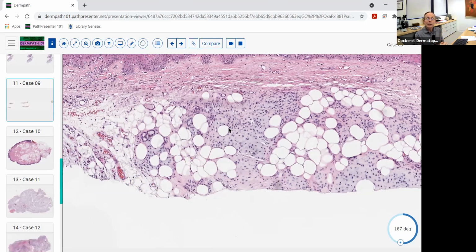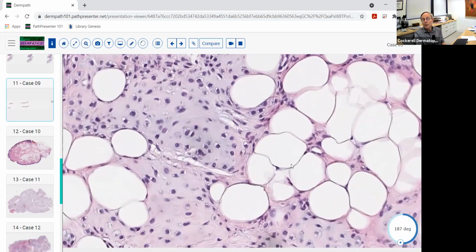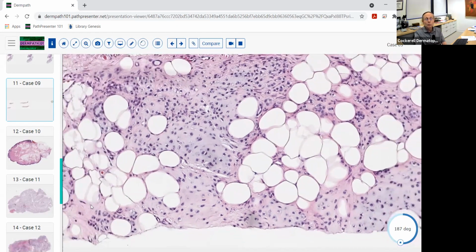So they get the abnormalities, the partial gigantism and soft tissue overgrowth, and occasionally you biopsy one of those, and it shows changes like this. So just realize that basically, if you get a neoplasm of fat plus cartilage, it can develop in a couple of different ways. It can actually be a true combination of fat and cartilage, or it could be a myxoid lipoma that's undergone cartilaginous metaplasia, cartilaginous differentiation. So that's just another interesting variant.